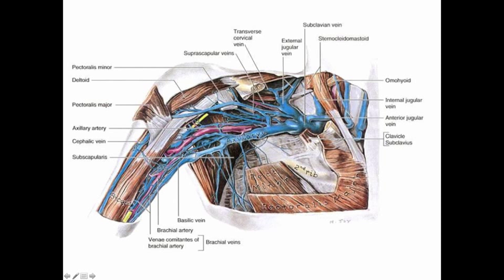Classically, as you know, the subclavian vein lies on top of the artery, which is why folks don't worry so often about hitting the artery instead of the vein, although it can still happen. Using ultrasound can help to prevent that.